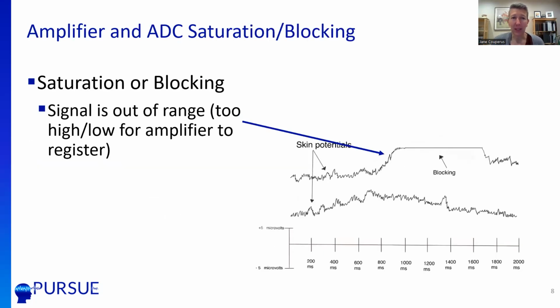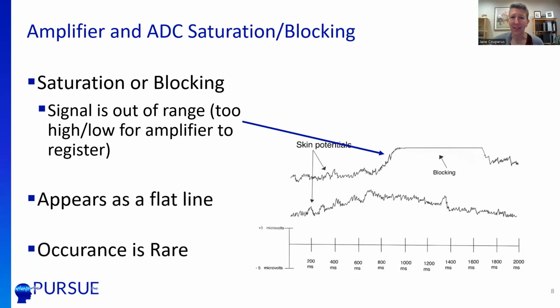You can also have something called saturation or blocking. This is when the signal goes out of range. This really doesn't happen very often, and it appears as a kind of a flat line, but it is something to be aware of. And that's simply that the electrical activity has gone out of the range of what the amplifier can actually deal with.